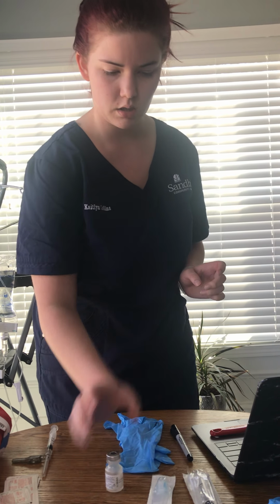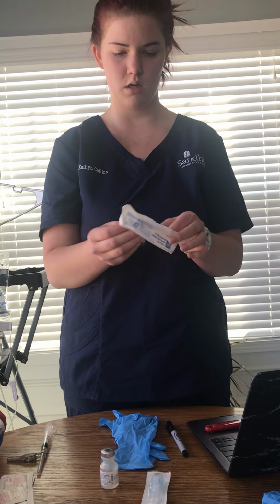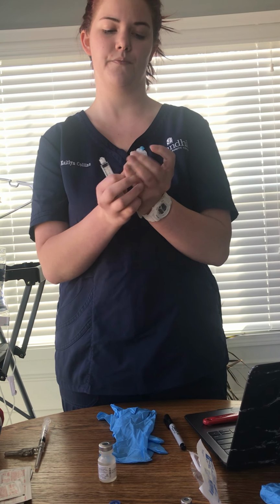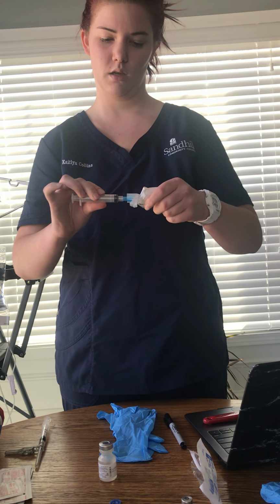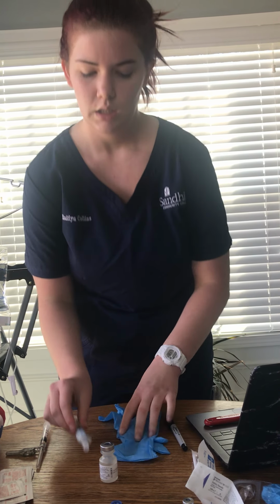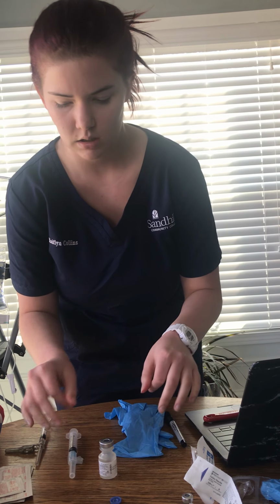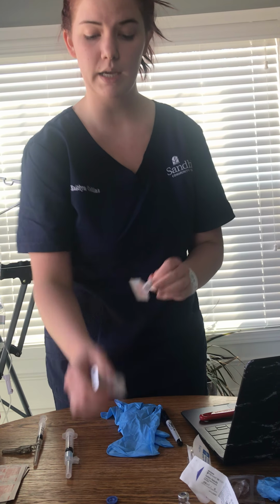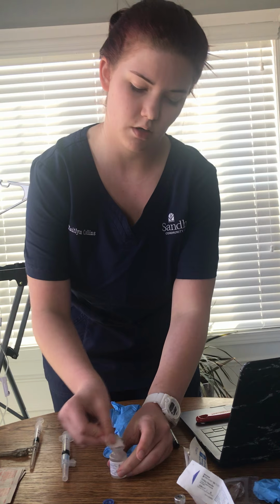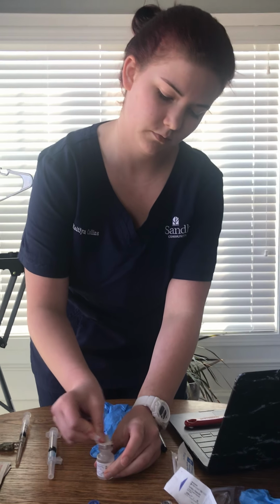All right, so I'm going to get my other syringe here, and since this is already, I'll pop the cap of this, trash, and scrub this for 30 seconds.